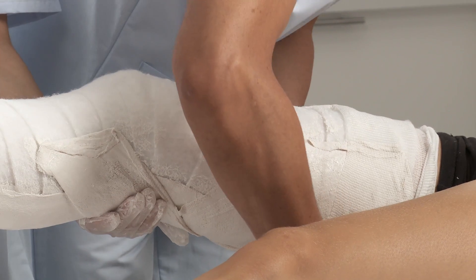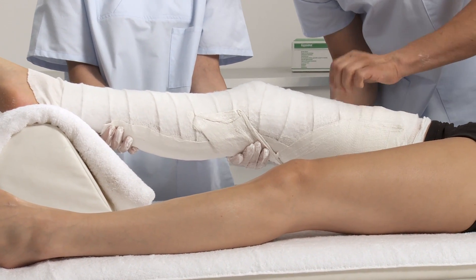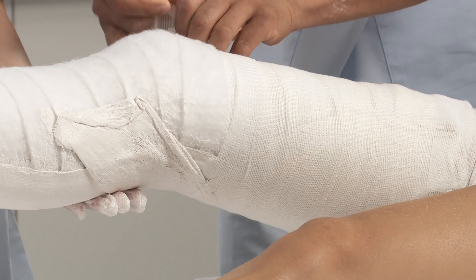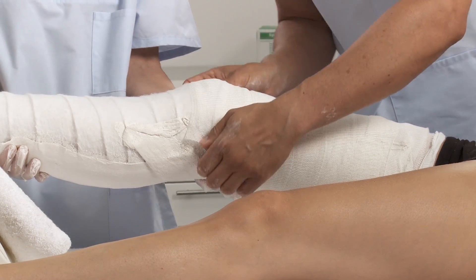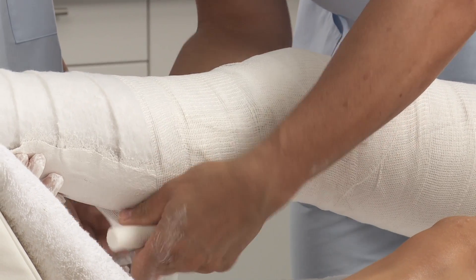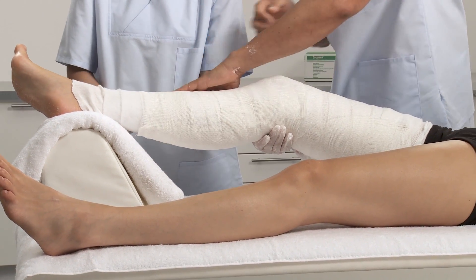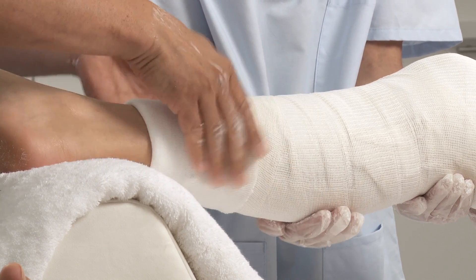Secure the splint into place with bandages. Fold down the stockinette at the proximal and distal ends. Smooth edges provide skin protection and comfort.